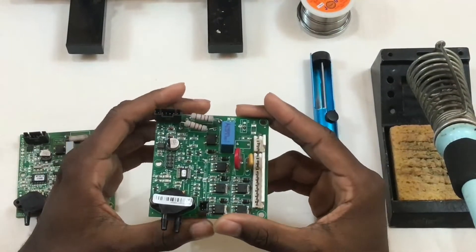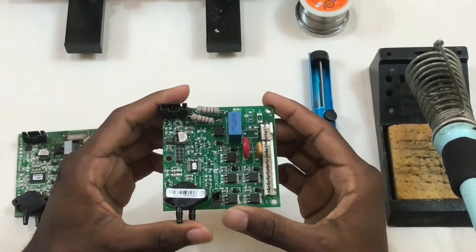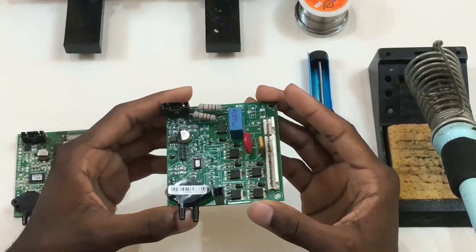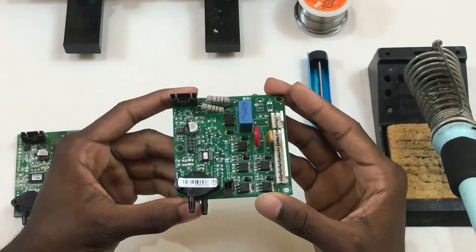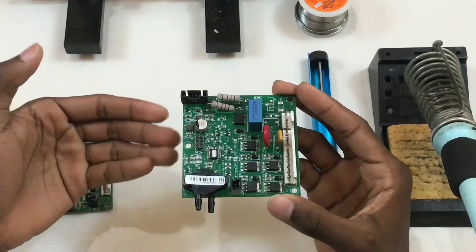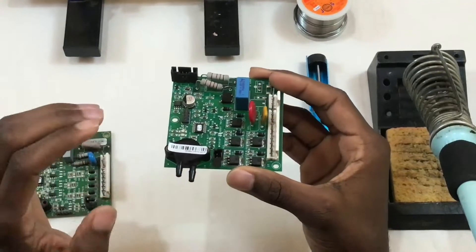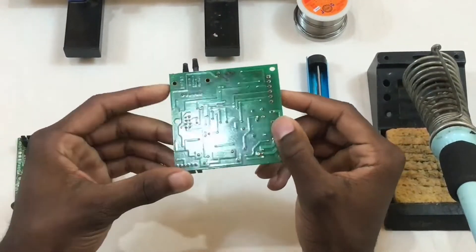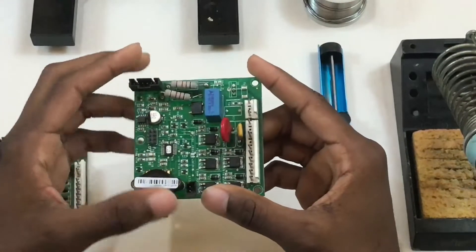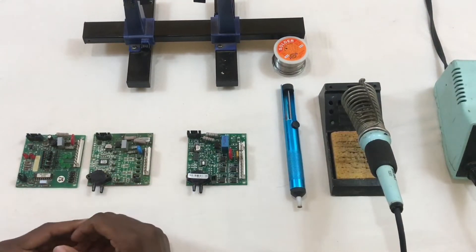For the third and most current generation of the AirSafe boards, they are still using surface mount technology for most components, and only through-hole technology for the power supply components, just like in the previous generation. The main difference between the third and second generation is that AirSafe decided to get rid of the LEDs that show the solenoid valve status. On this board there are no LEDs, just the transistors that control the solenoid valves. The bottom of the board is surface mount, much cleaner and smoother compared to the first generation.